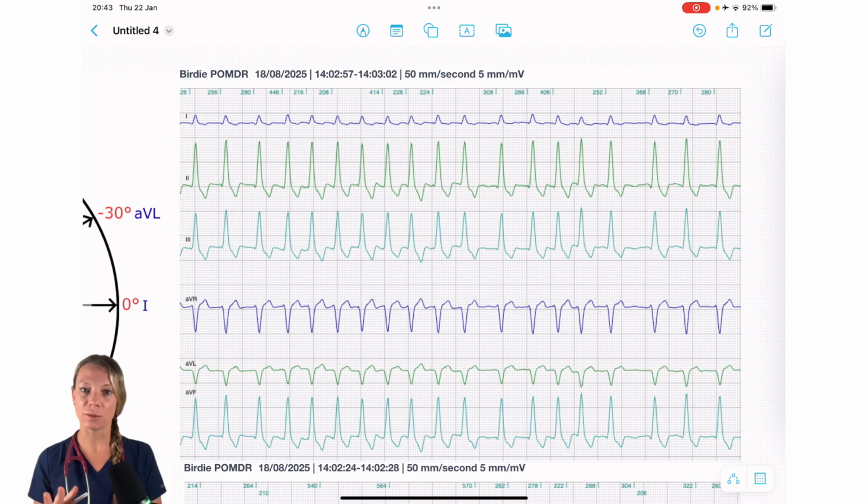I teach ECG interpretation through physiology and electrical mechanisms rather than pattern recognition. By the end of this video, you'll be able to take an ECG like this and explain what's happening electrically and understand why atrial fibrillation can be destabilizing, particularly in dogs with underlying myocardial disease.